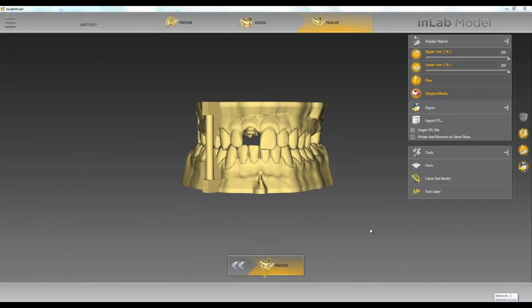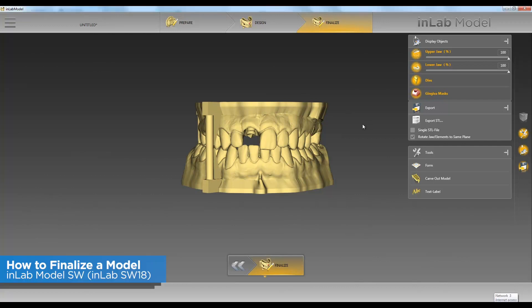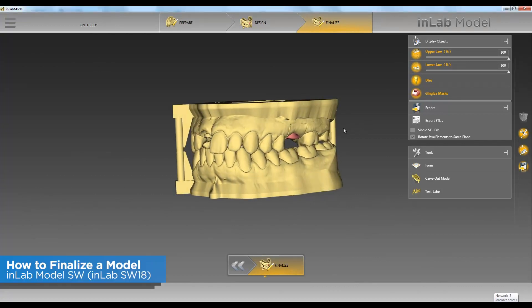Hello, this is Jay Black with Tekken 2. In this video we're going to go over how to use the different tools in our finalized phase.